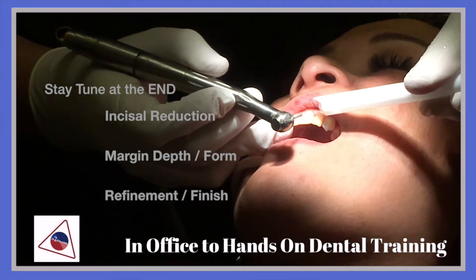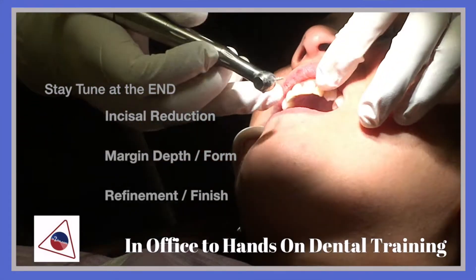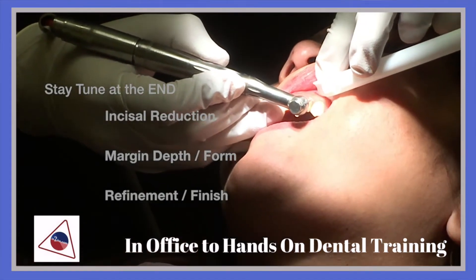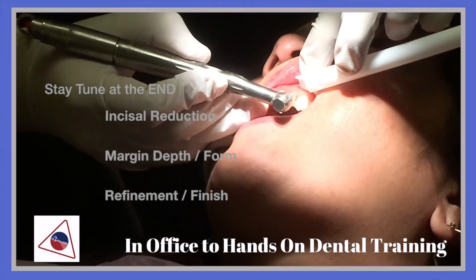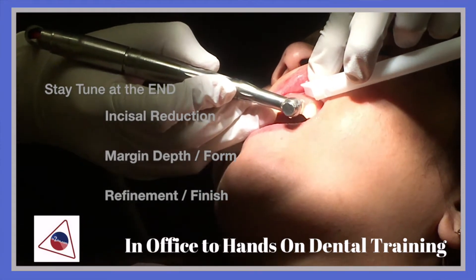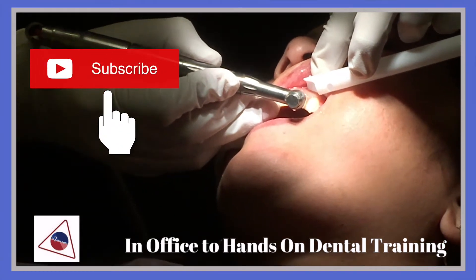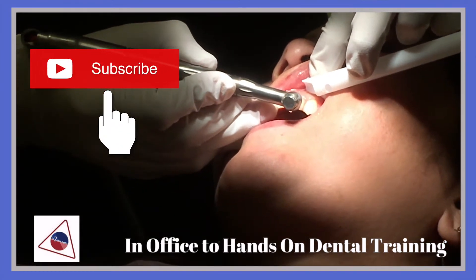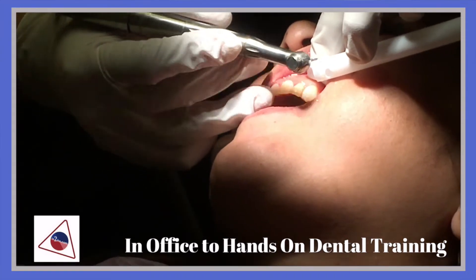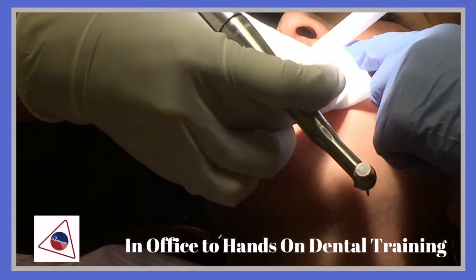At the margin, right here, you will see where the water goes as I start prepping the tooth. See how the water is going into the suction tip where the margin is? I am getting the margin and you are getting all the water.